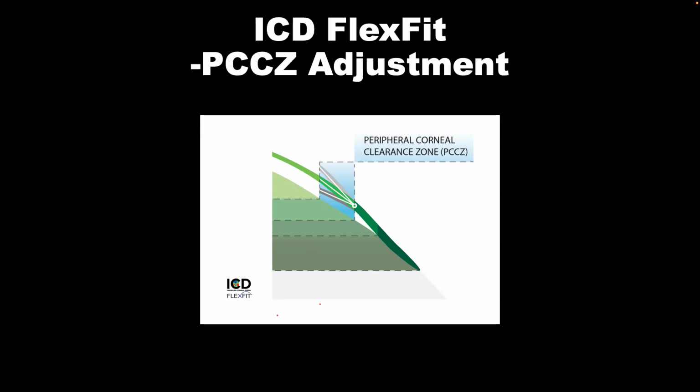But let's make an example. Let's say you have over 500 microns of central clearance. Well, basically, if we have 500 and you just want to make changes, then you would just go with lowering the central sag by doing either base curve, basically a joint change between the central clearance zone, doing changes with the base curve and the peripheral zone. Just try, because that way you won't be changing that much the design.